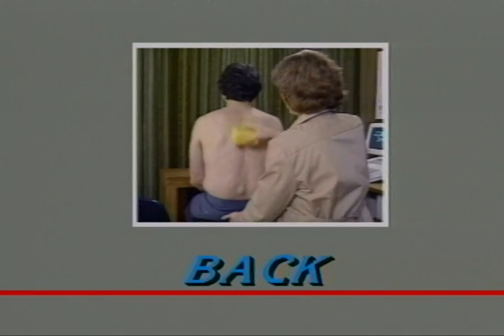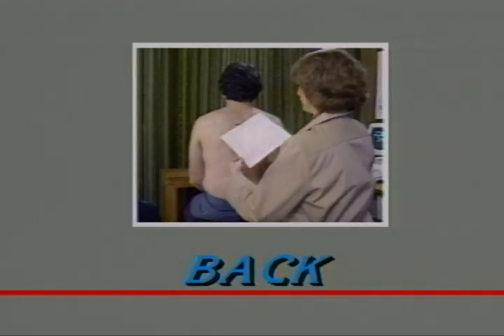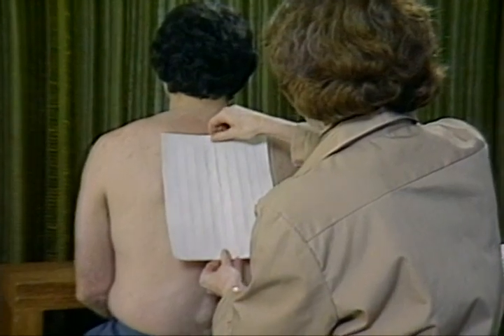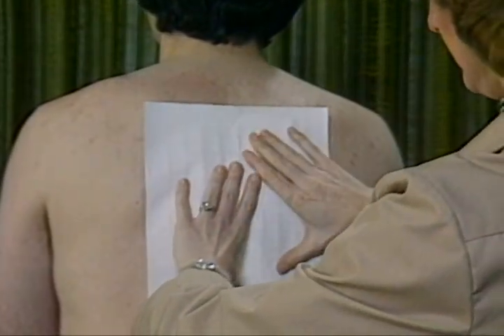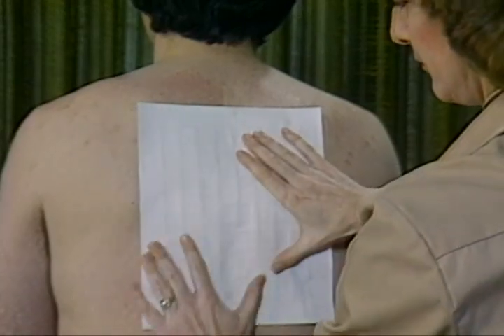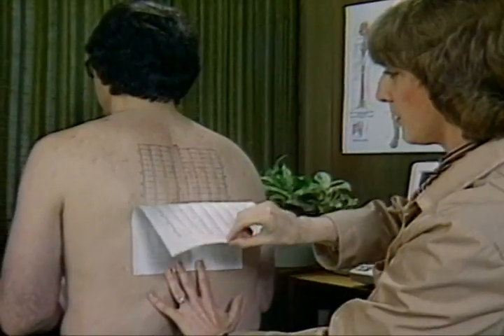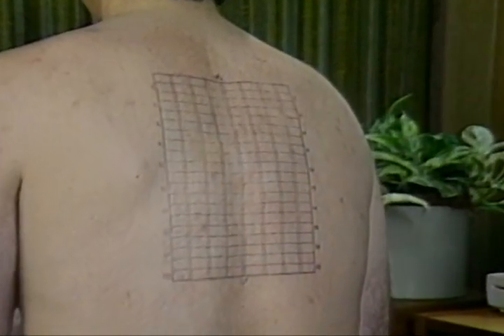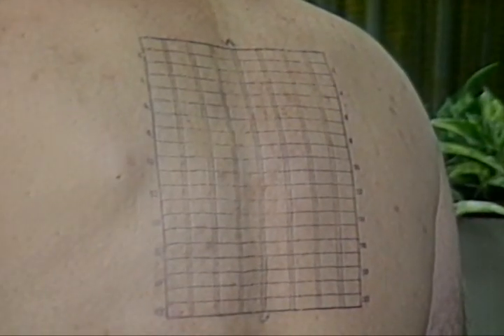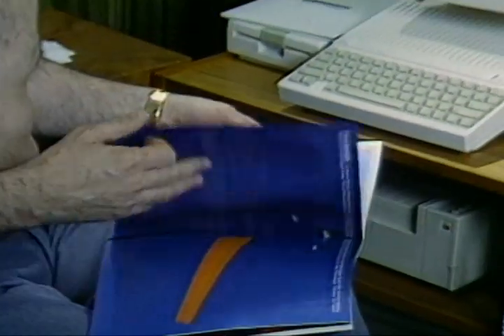Then the operator uses the GST locator to place a scanning pattern on the patient, covering the region to be examined. This grid provides a visual guide for moving the heat sensor over the body without changing the body's surface temperatures. It also provides a map of how the thermal information enters the computer and how it will later be displayed. At the end of the exam, the pattern can be removed with a damp cloth.